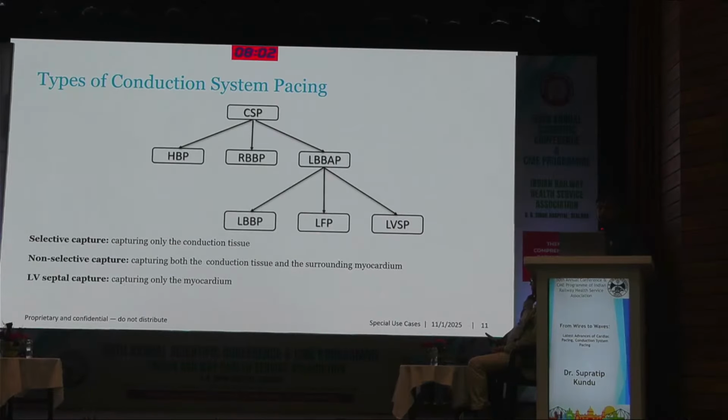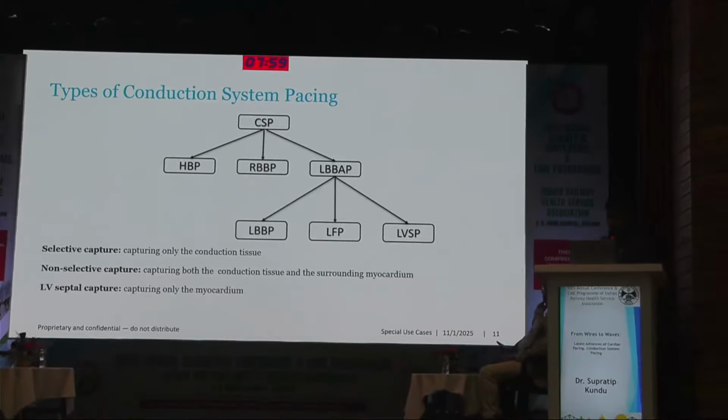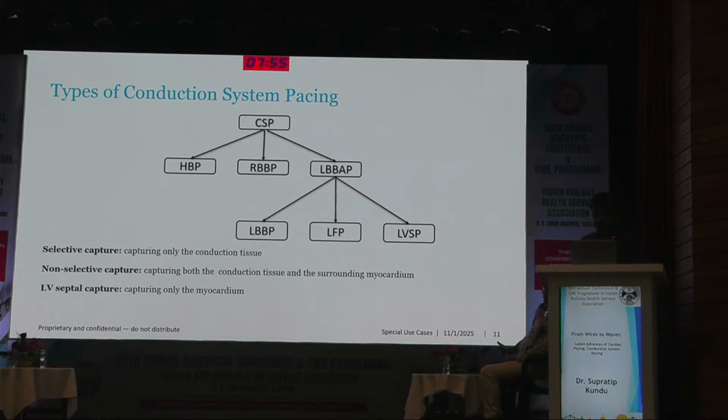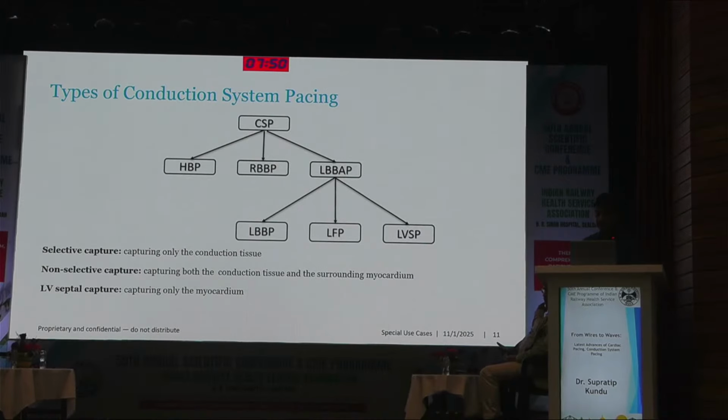Selective capture means capturing only the conduction system. Non-selective capture means capturing both the conduction tissue and the surrounding myocardium, and LV septal capture means capturing only the myocardium.